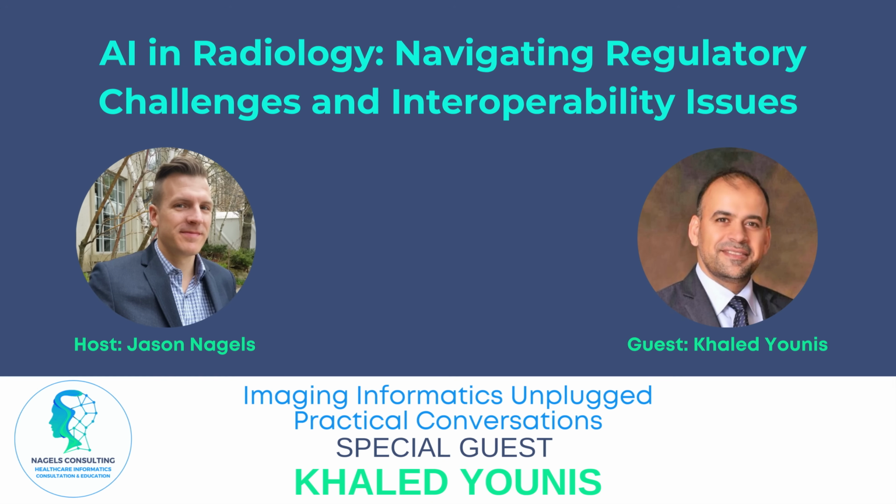Basically, that has been there for a very long time, but it did not reach the maturity and reliability that we have right now. Generative adversarial networks are one example, and they've been used to create realistic images for AI training. You also have CT and MRI, where they can generate anatomically accurate synthetic data. But things have started to pick up speed.